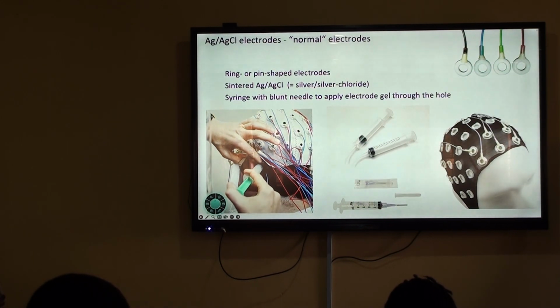And to be honest, I think the biggest challenge that we would have with African participants is not so much the head size, but the hair. How do we accommodate African hair, especially from female participants, in the caps that we have? For example, you have a lot of hair, so that's going to be challenging. If I measure your head circumference, I would choose a cap, but if I look at your hair, I know that I should better use a larger cap, because otherwise your hair is not going to fit underneath. And it's those types of things that I think are important to discuss as well.